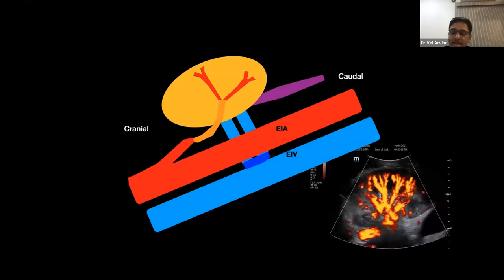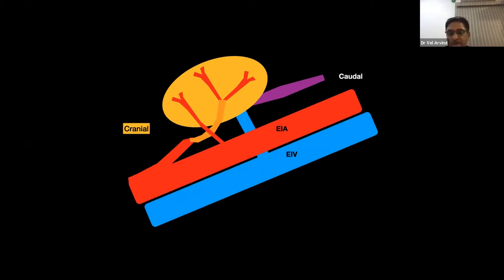These kinds of details, unless you have a note, rely on memory. For all my patients, I am inside the theater and part of the surgical work, so I know where it is. But otherwise, even the sonologist cannot find it, and they may report one as a vein and one as an artery sometimes, because of the aliasing effect. So these minute points should be mentioned and documented properly. As a learner, as any beginner, I recommend please follow this simple documentation. It will go a long way in your career, help you manage patients well, and your diagnostic ability will go up manifold.